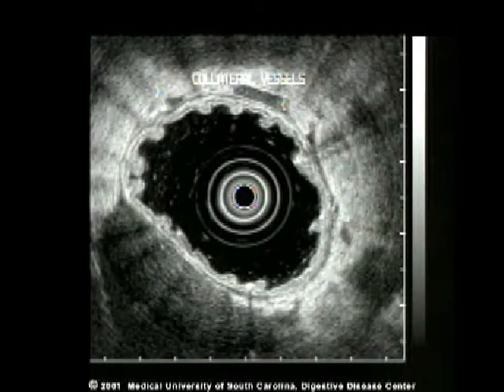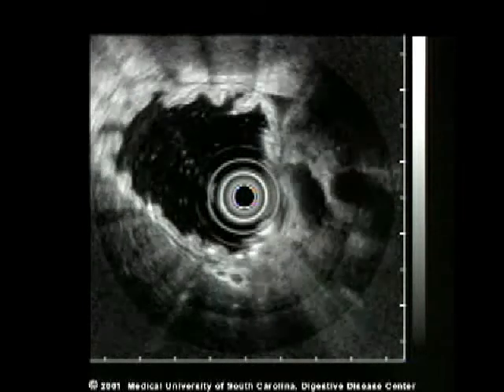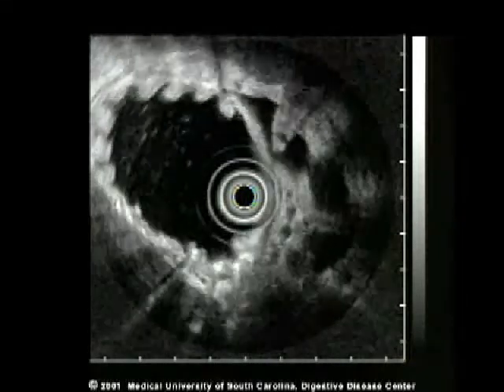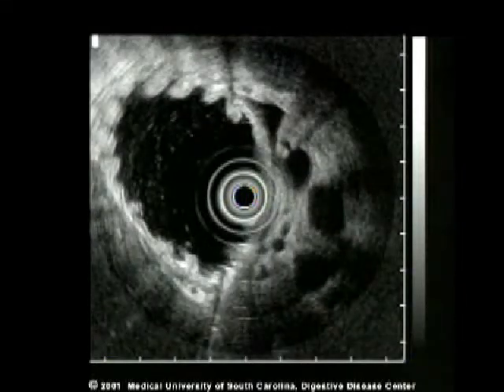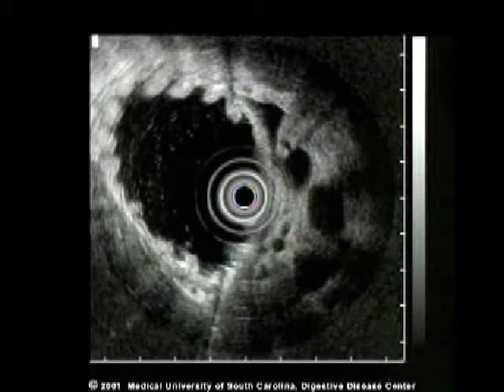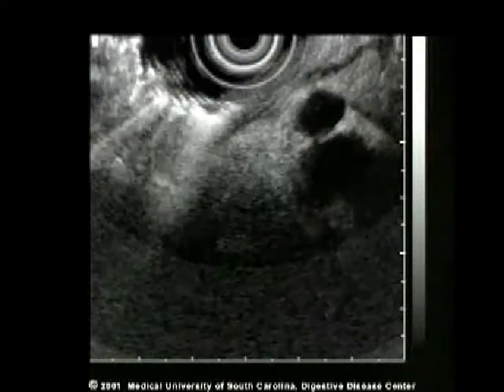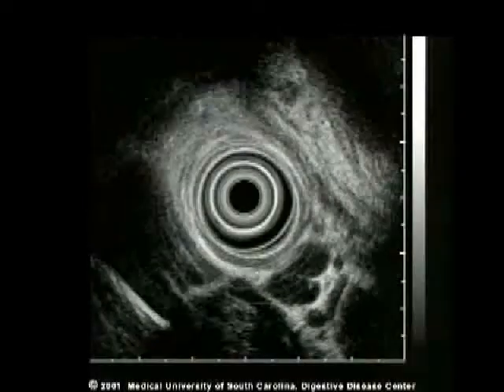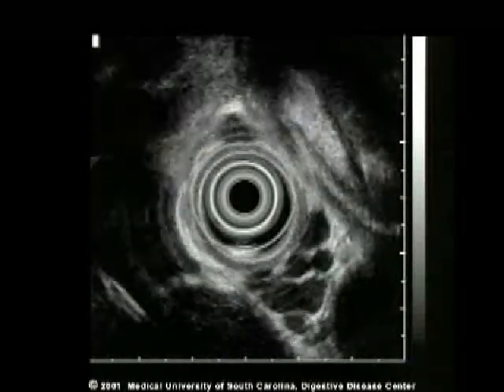These blood vessels seen at the top of the screen do not cross the wall of the stomach and are thus collaterals and not gastric varices. Again, esophageal varices are very easily identified with the EUS scope, sometimes in the absence of endoscopically visible varices.